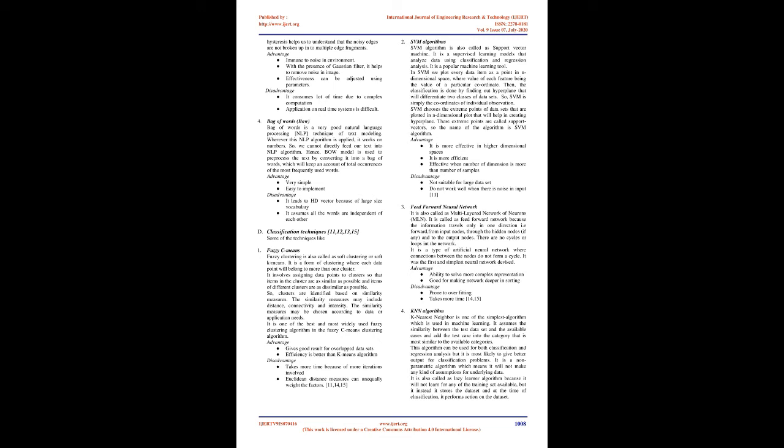Feature extraction. The best known feature extractions are: 1. Local binary pattern, LBP. It is known for its simplicity and efficiency in texture operation and it labels the pixels of an image by thresholding and considers the result as a binary number.